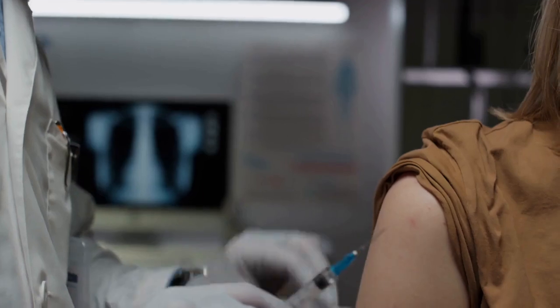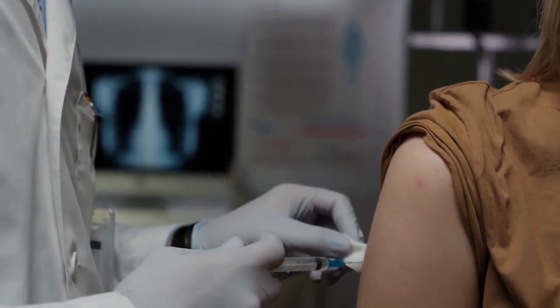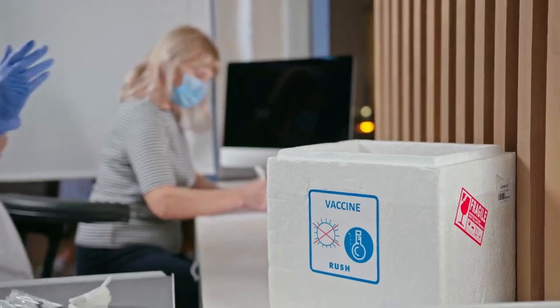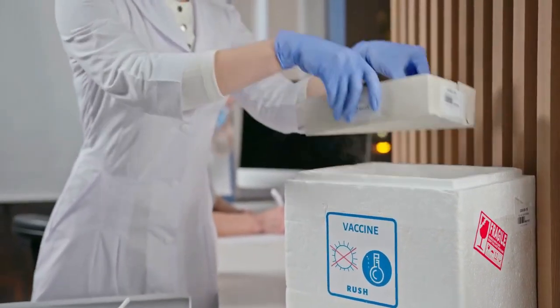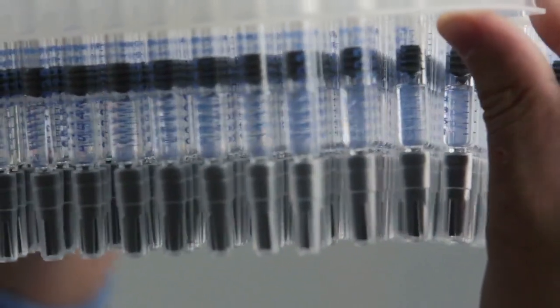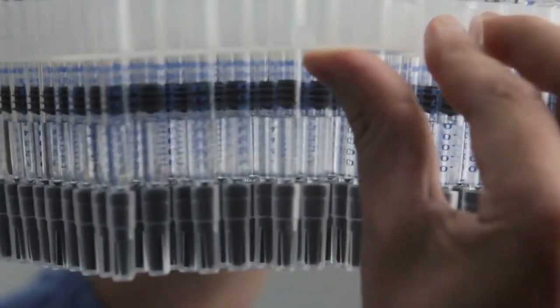Step 6: Gently mix the solution. Once the diluent is added, gently swirl the vial to dissolve the artesanate powder completely. Do not shake vigorously, as this can cause foaming or damage the medication. Make sure all the powder is dissolved before proceeding. Inspect the solution for any unusual cloudiness or particles. If present, discard the vial.